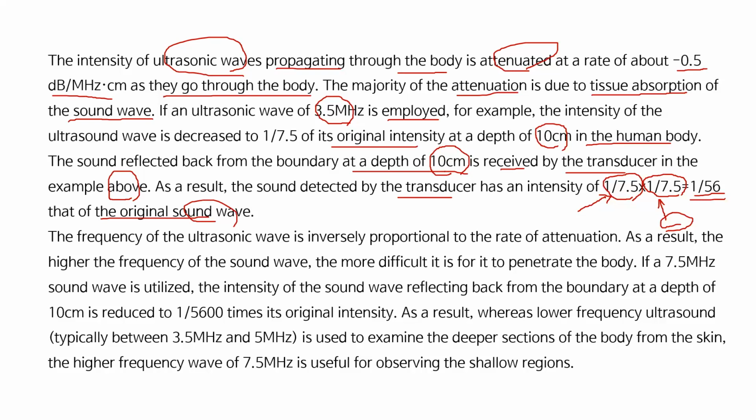So we have just 1 over 56 of the original sound wave that can be detected for the backscattered sound wave from the 10 centimeter depth of the body.